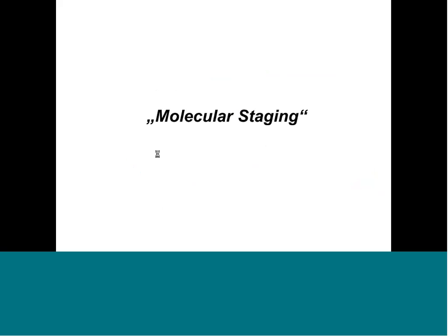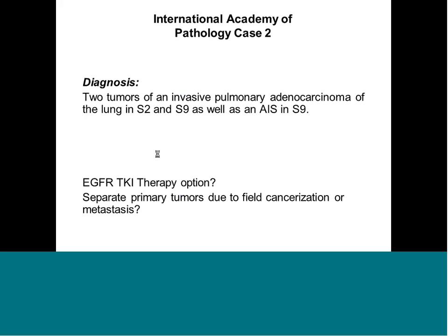Molecular staging. It's a big question if you have patients with multiple tumors. What is the metastasis and what is the second tumor? Because that heavily influences clinical decisions. I show you just briefly 2 cases I teach for the International Academy of Pathology. Here we had 2 tumors of invasive pulmonary adenocarcinomas in segment 2 and 9. And the question was, is this a primary and a metastasis?